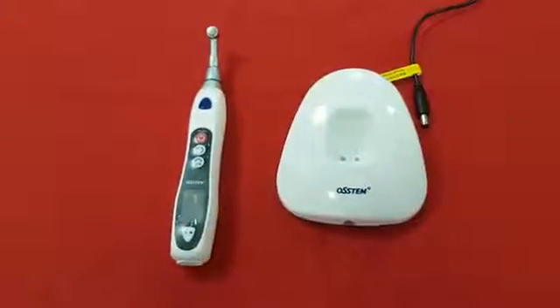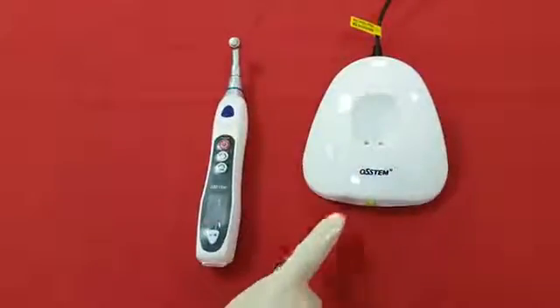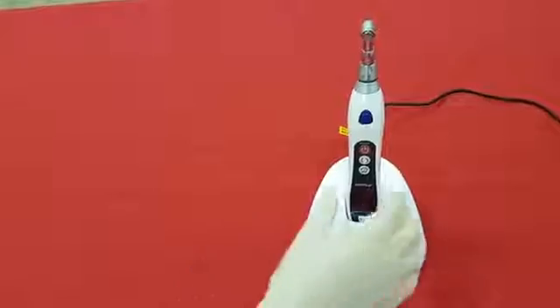These are the components of E-Driver. Power cable and the cradle will be connected to charge the battery. Normally, you can see the green light and it is changed into red while charging the battery. After recharging, you can use this approximately 1 hour.